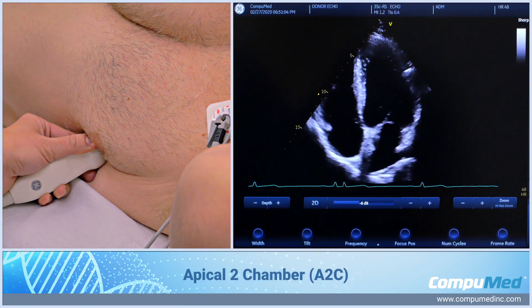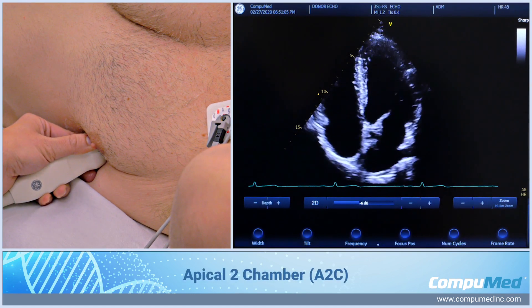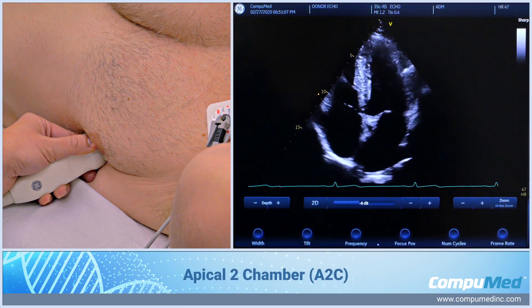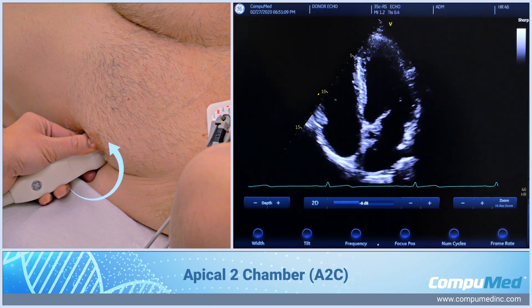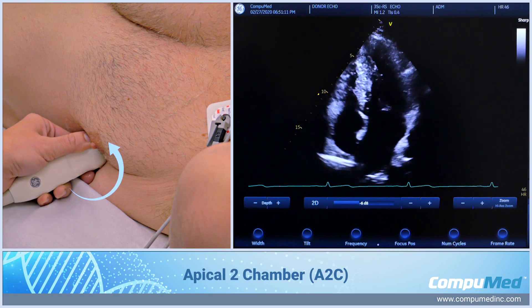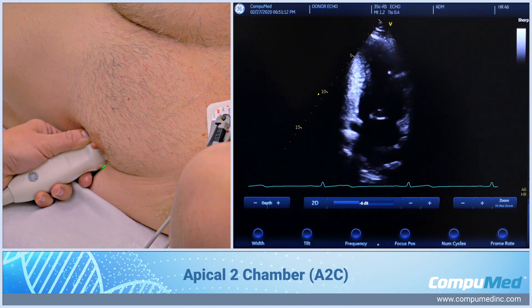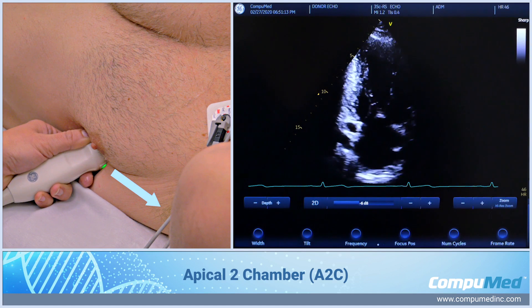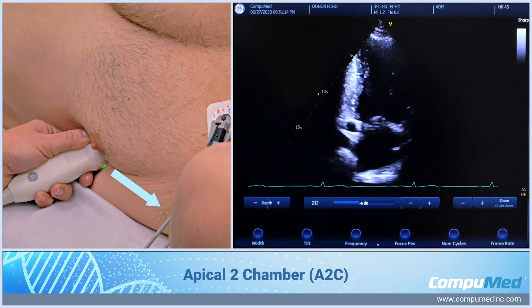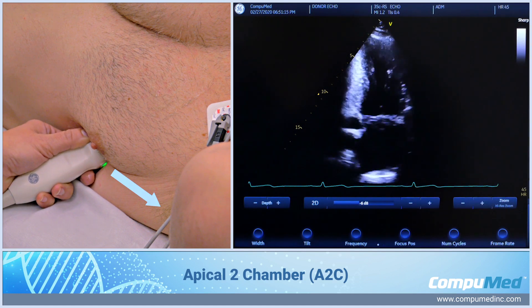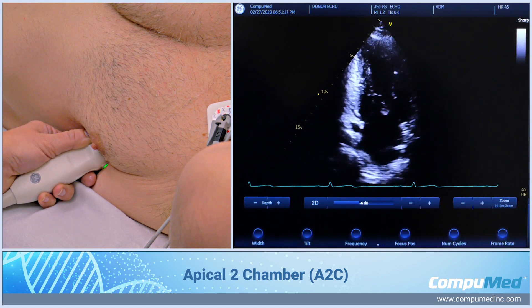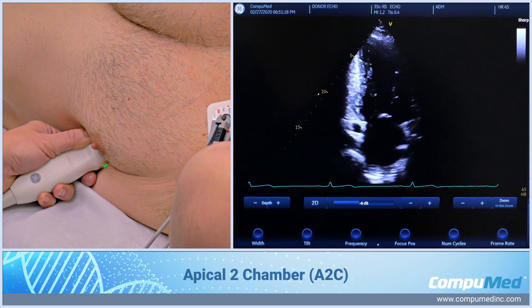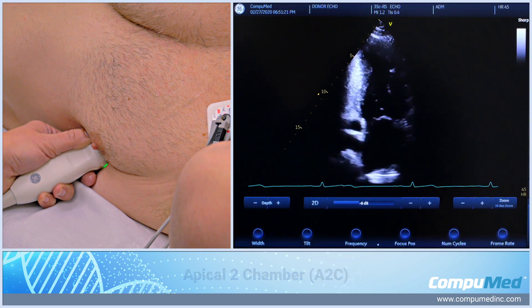From our apical 4-chamber, to rotate into our apical 2, I'm going to rotate my transducer counterclockwise towards 1 o'clock. My index marker is facing that way, and I'm going to angle inferior a little bit to bring in my apical 2-chamber.